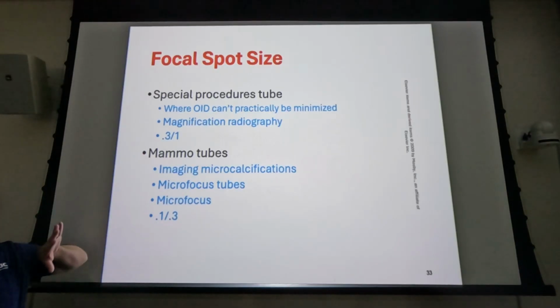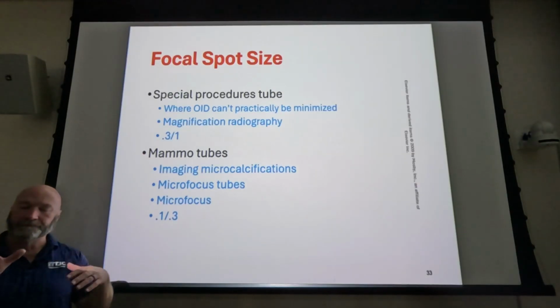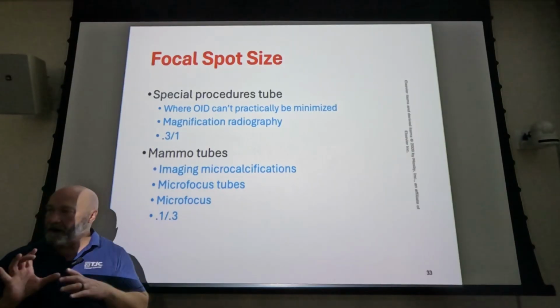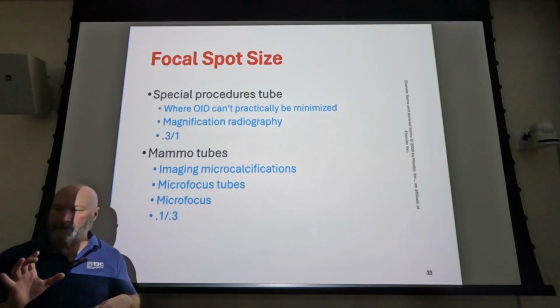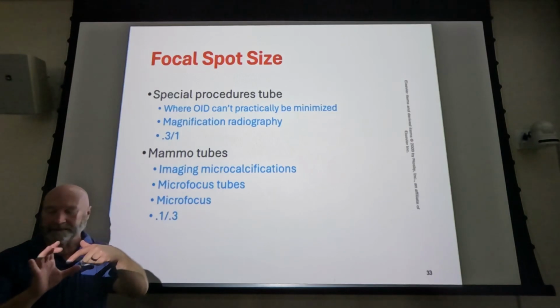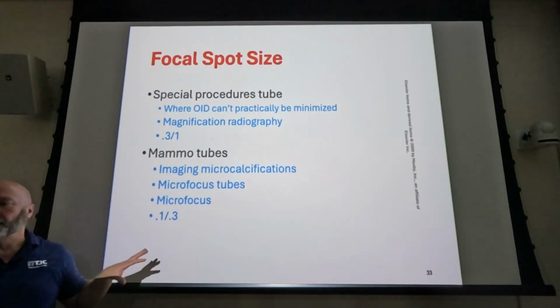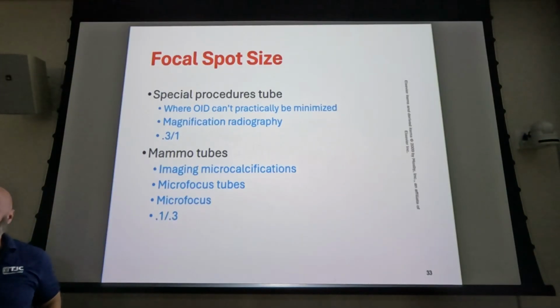What happened is I backed my hand up. It got big, right? So with a C-arm, you have an X-ray tube and an image receptor, which is an image intensifier, on opposite ends. You put the anatomy dead square in the middle, so you have a pretty massive increase in OID, right? So with increased OID, what do we do to overcome that magnification?